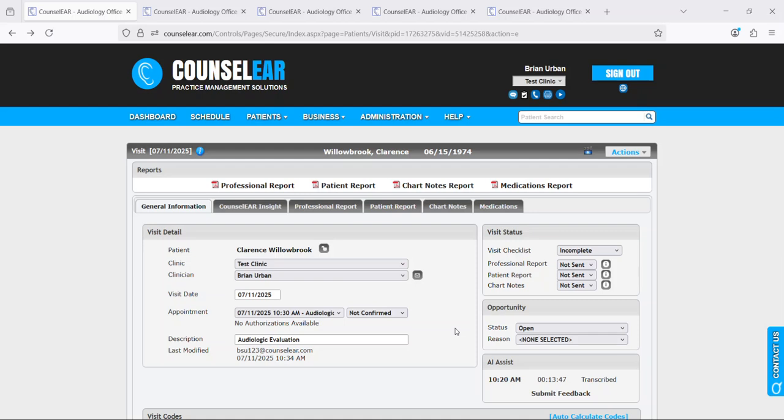Welcome to the Counselor AI Assist overview. In this tutorial video, we're going to show the process for activating Counselor AI Assist as well as how to utilize it within a patient visit.